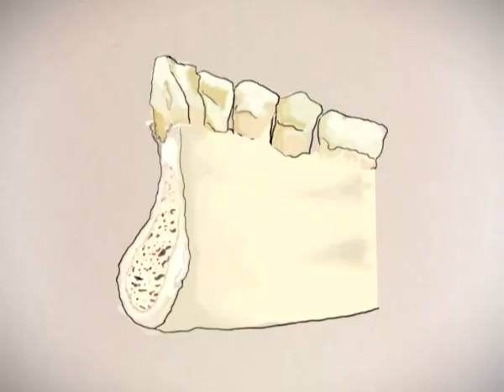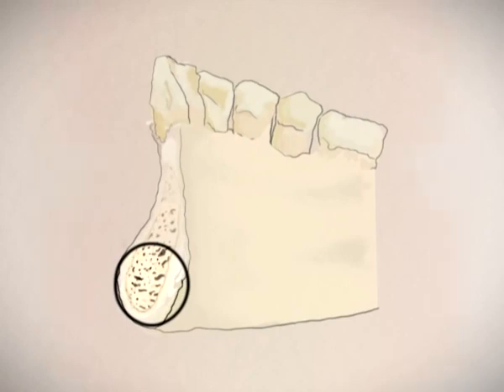The traditional inferior alveolar nerve block has the lowest success rate, approximately 85%, of all nerve blocks administered in the human body. Most of the time, the problem occurs in mandibular molars. The reason has to do with the thick cortical plate of bone in the adult mandible, which precludes the administration of infiltration anesthesia. The most common reason for missing the inferior alveolar nerve block is injecting too low. As most doctors realize, injecting a little bit higher is a little bit better.